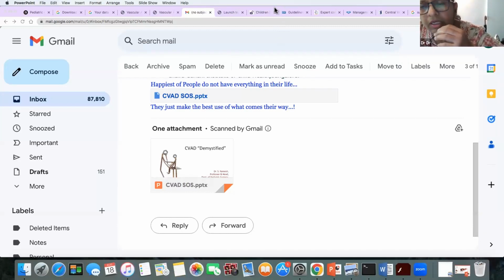If it is close end, there is less chance of thrombus on the tip. Maybe the wall opening is a problem, and it is external. If external, you check that the length is the same, and you are not finding a big length outside. That means the tip is most probably in the same position. When you are putting it in, you write how much you inserted, and you look for the same size afterward. So forward flow is there, and there is no need to worry. You can administer 100 ml normal saline. After the 100 ml normal saline goes in freely and there is no pain or other problem, you can administer the other drugs also.